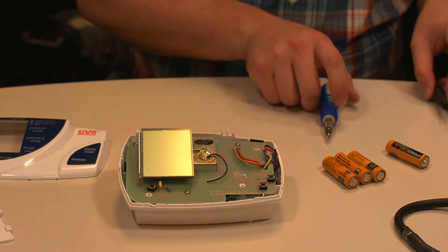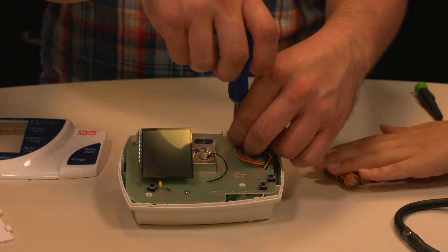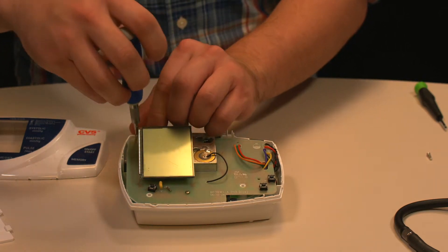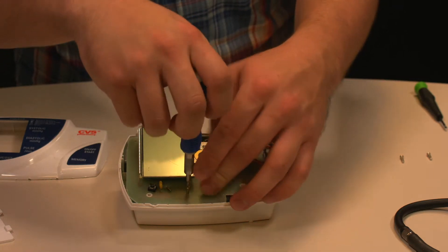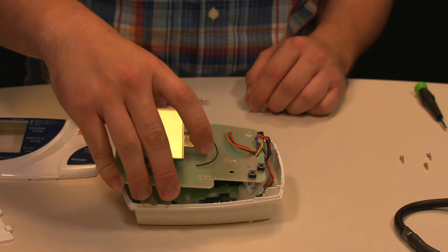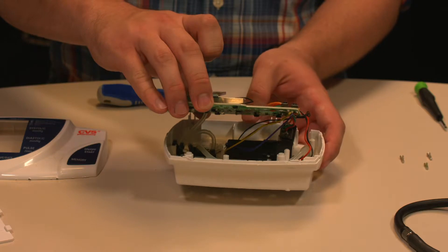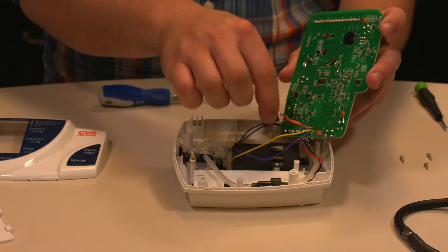The third step is to unscrew the circuit board on top. There are three screws — make sure you know the order you took them off and where they go, as they're all different. It will pop right out once the screws are done, but watch the wiring and tubing because everything is connected closely in there. It's best to take off the tubing attached to the circuit board so you can get at the internal components. Note that the adapter will come out of its slot but can be put right back in.